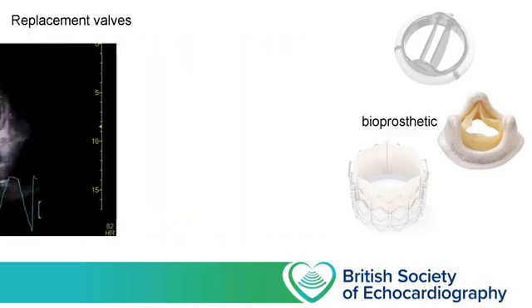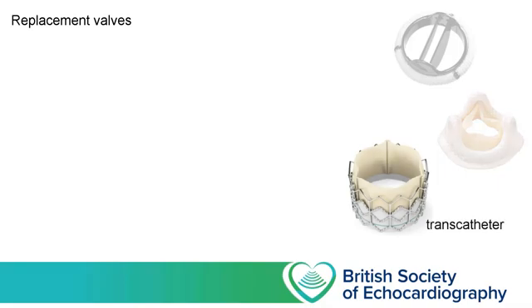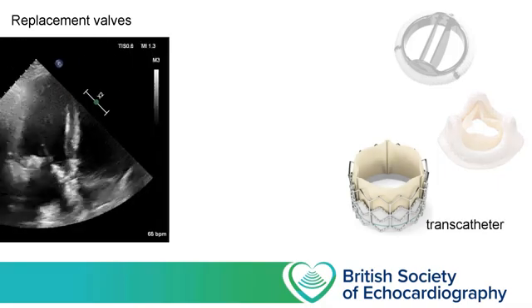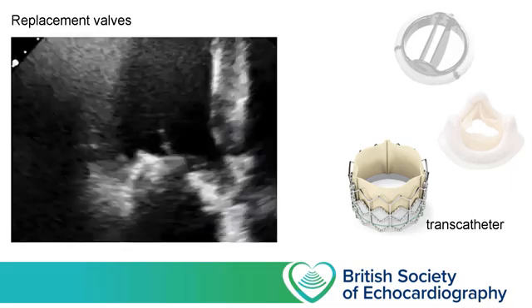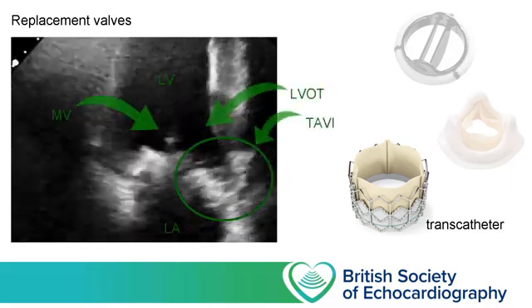Percutaneous transcatheter valves are growing in popularity, in a large part because they can be offered to patients who wouldn't be suitable for conventional cardiac surgery. This next clip is from a patient who has just deteriorated following a TAVI procedure.